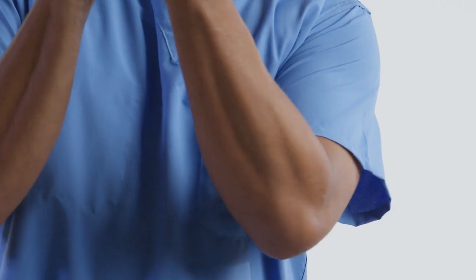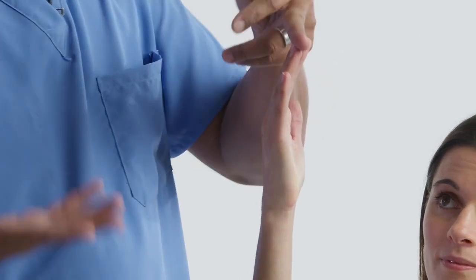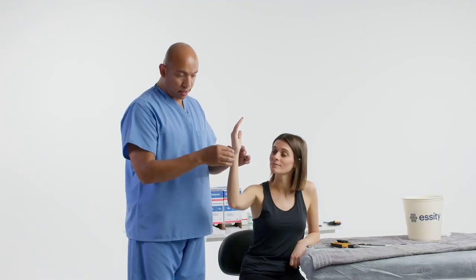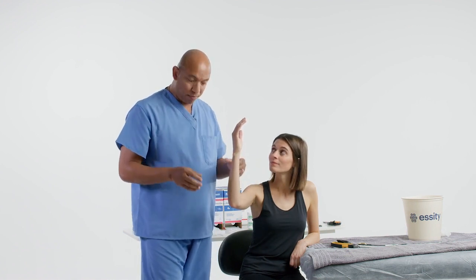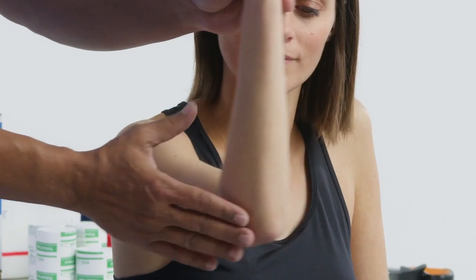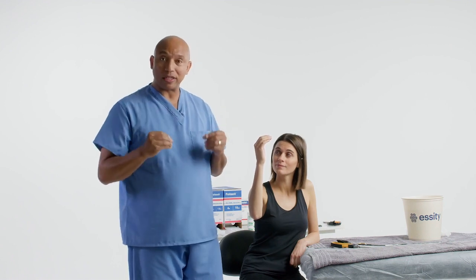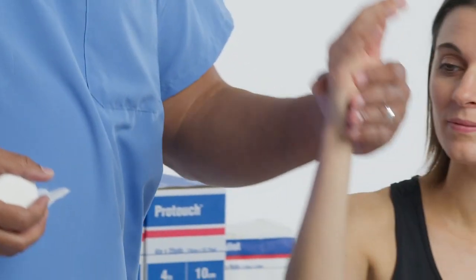The injury is there, but our goal is to stop our splint at the distal palmar crease. When we do our measurement, we'll measure from the ring finger all the way around the elbow and back up to the ring finger. This is not the regular sugar tongue. The patient position will be at 90 degrees at the elbow, with the wrist in a neutral position unless the provider specifies flexion or extension. Let's measure, then apply some padding.